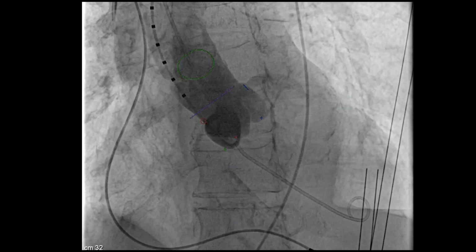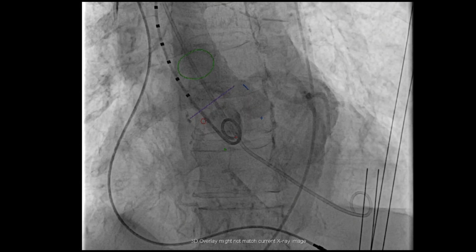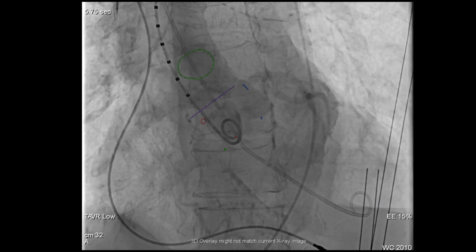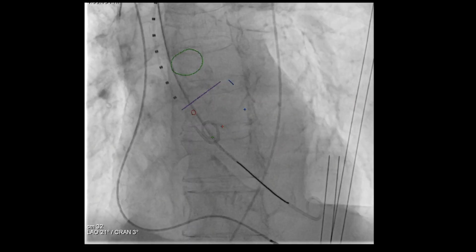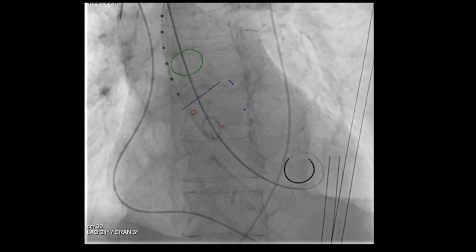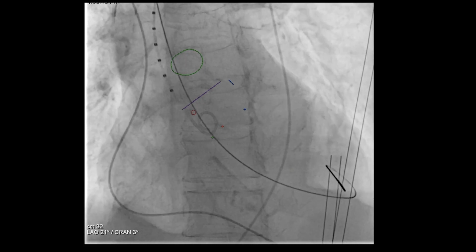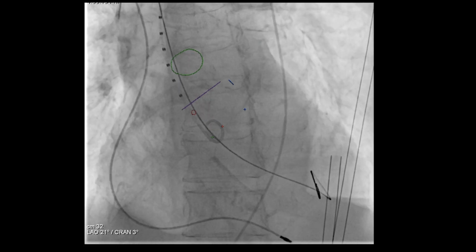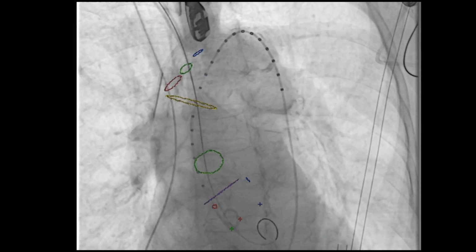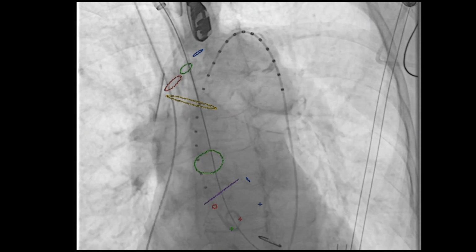A coronary angiogram was performed delineating the anatomy of the coronary vessels and the sinotubular junction. A super stiff Lundquist wire was then introduced in the left ventricle over a catheter. This was done to introduce a larger 18 French sheath through the right axillary artery access site. Patient was heparinized. Shown here is the introduction of the right axillary artery 18 French sheath.